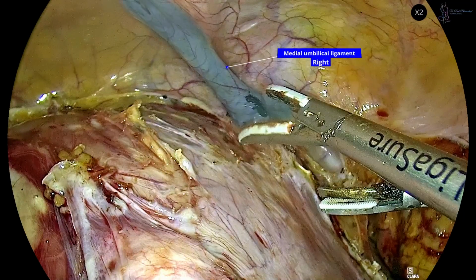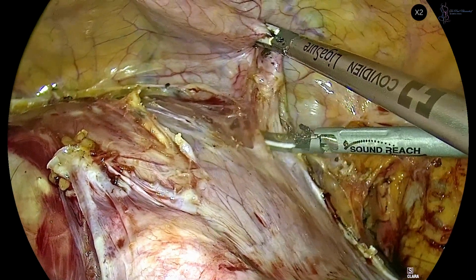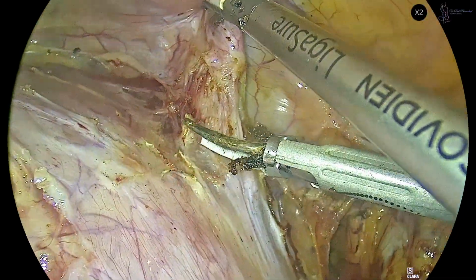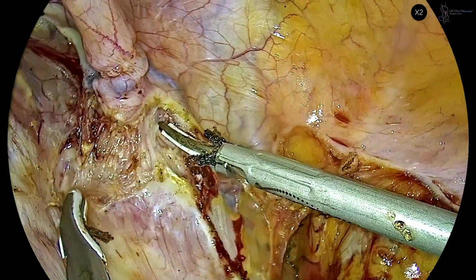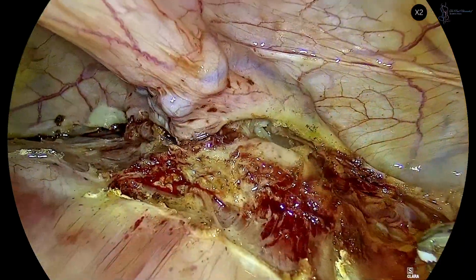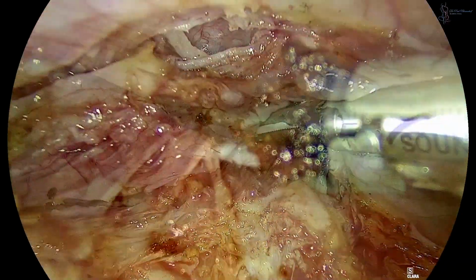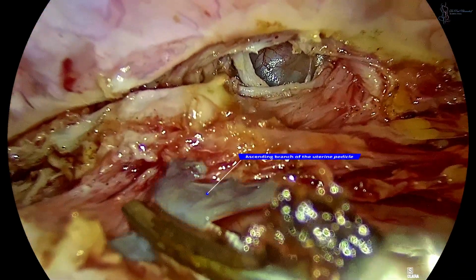A combination of diathermy and traction is placed on the right medial umbilical ligament as the peritoneum is dissected. Dissection and isolating of the ascending branch of the uterine pedicle.